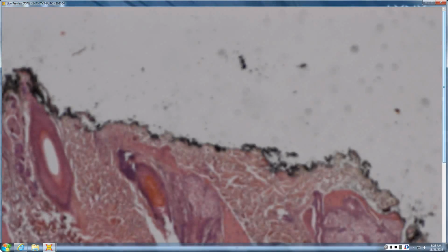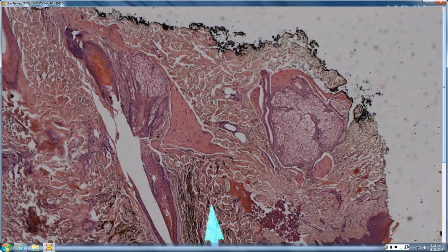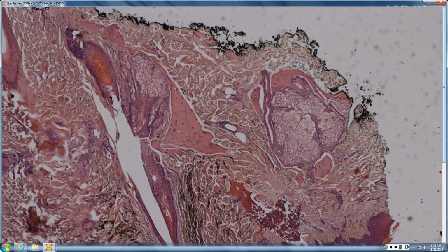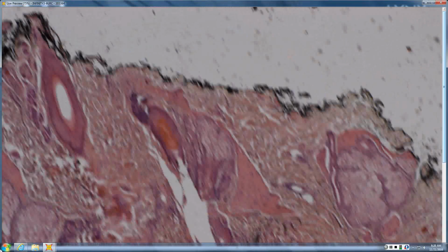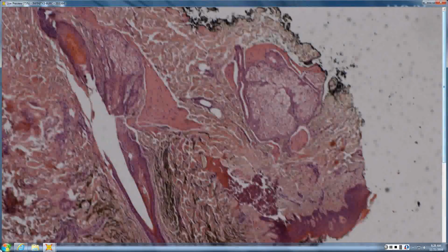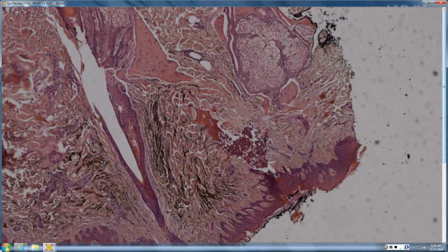I thought this was good for a blue nevus. So like good for a blue nevus, except it doesn't have a lot of its own stroma. Maybe this piece has more stroma. So this one really does look good for a blue. If it looked all like that, that might buy a little further evaluation for blue nevus-like melanoma.